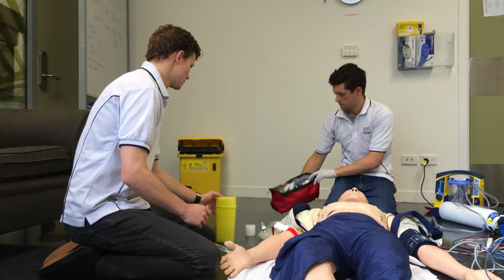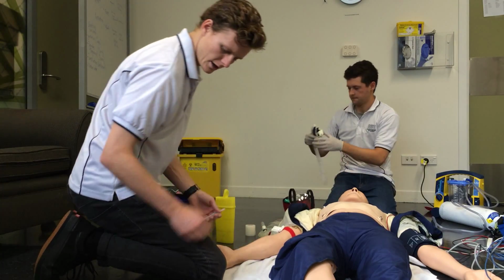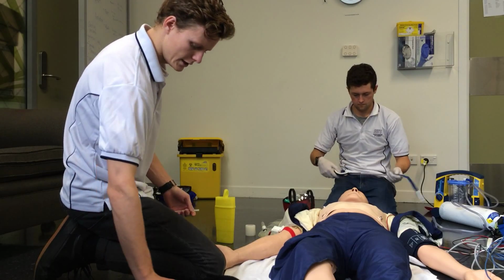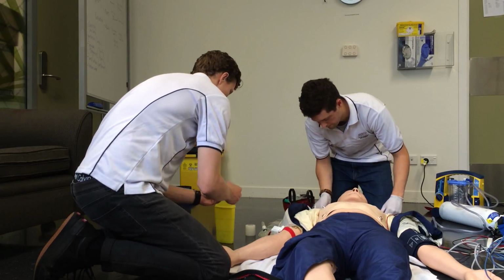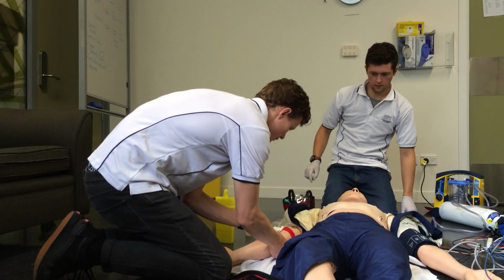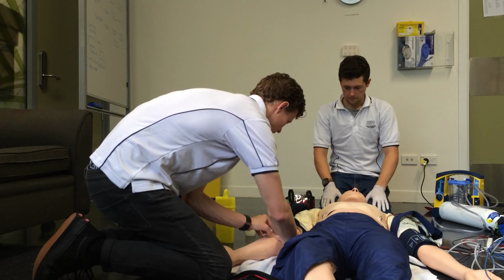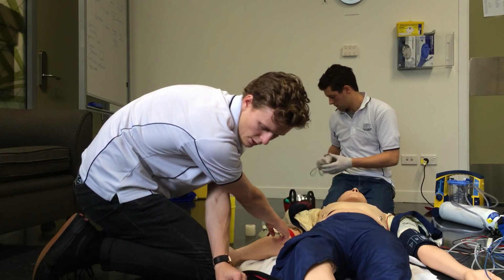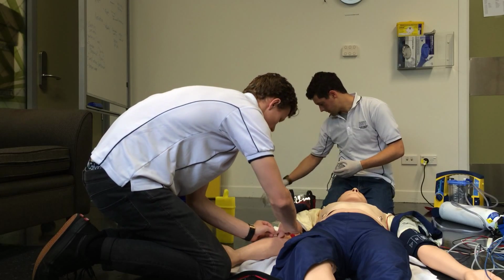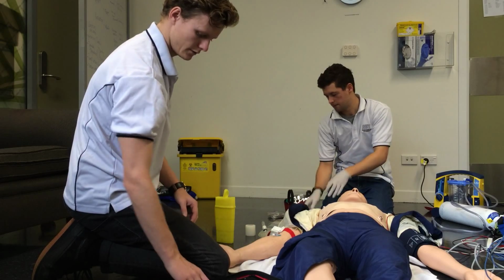Thanks, Jacob. So I'll swab the area. Looking at it, I've got my IV gear ready to go. Sharps live. Right, Sam, ET, towel and suction are there. What next? Can you get a reservoir mask out and place it on at 10 litres per minute, please? We don't actually have a reservoir mask, but we'll just use this. Sweet, so I've got that.